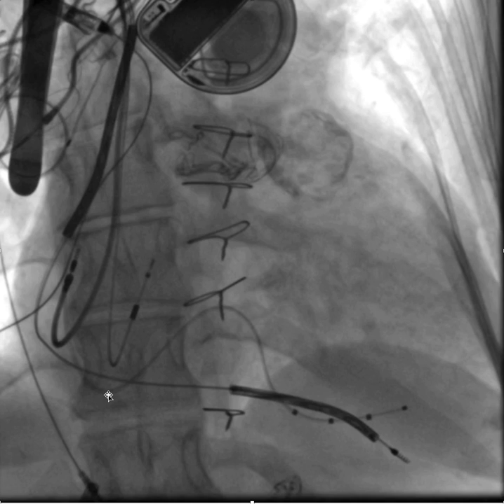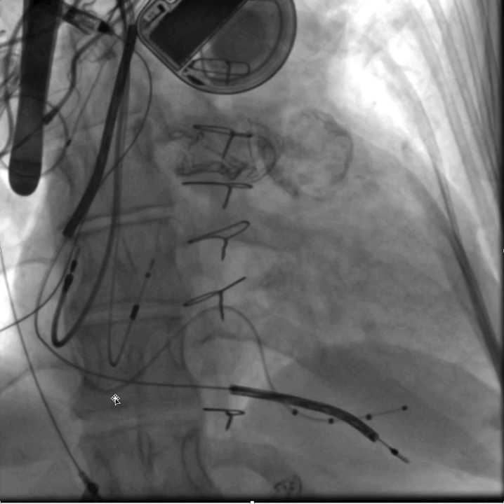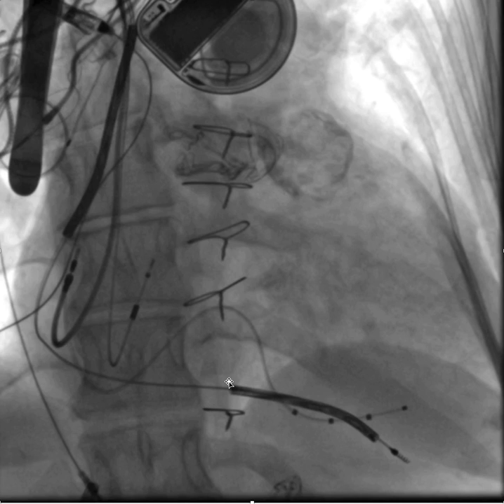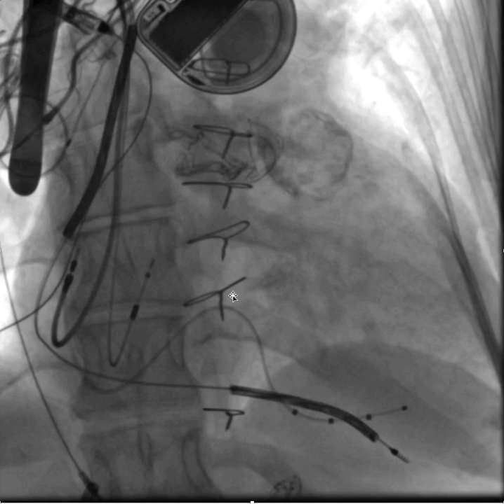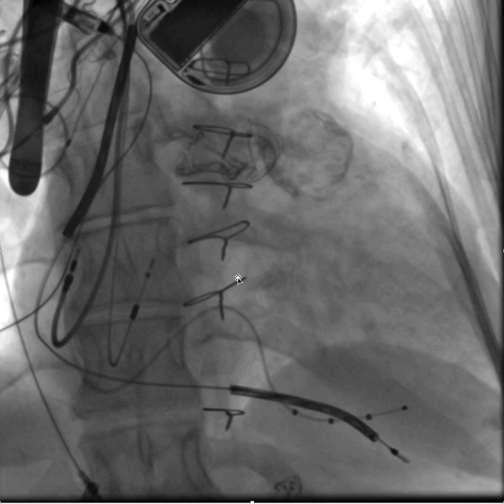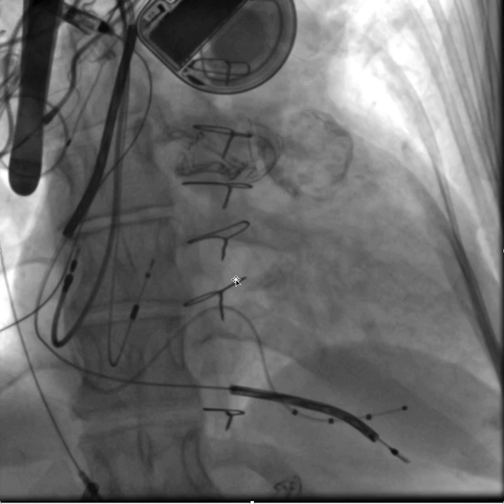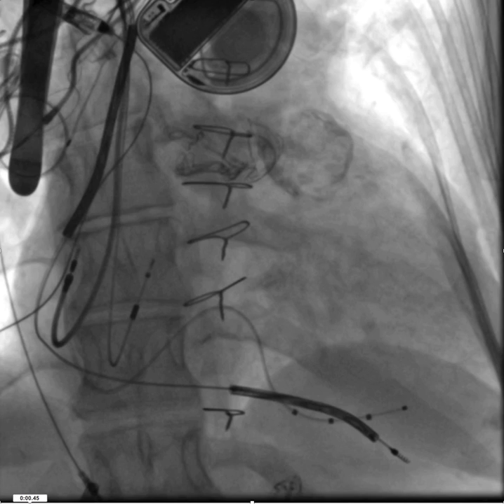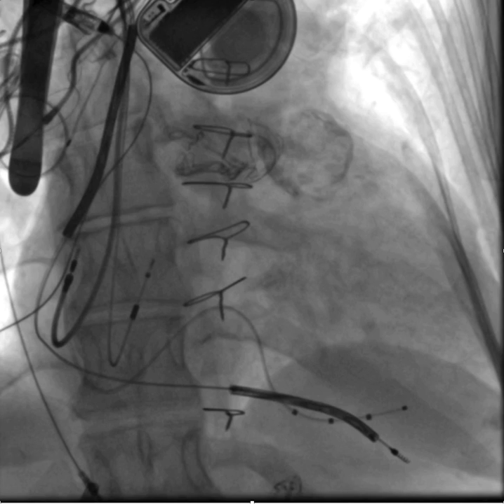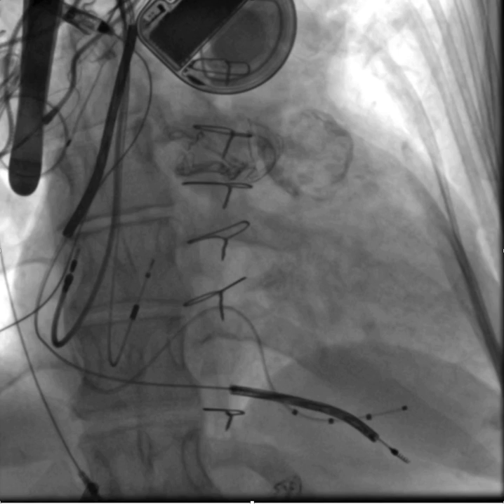Another location you can look to selectively cannulate would be at the os of the coronary sinus, using a support wire technique. This is easy to do and you can locate the middle cardiac vein and selectively inject that. I hope this helps for your patients with persistent left SVC.